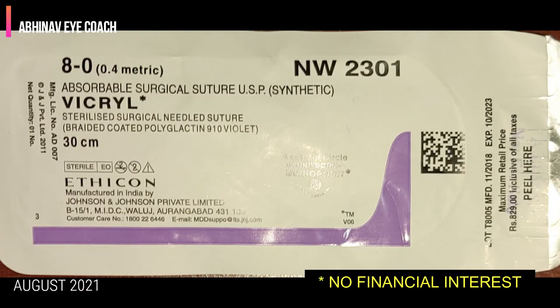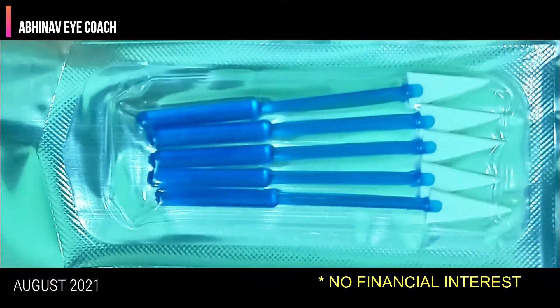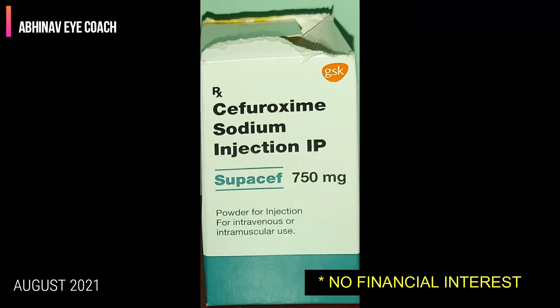These are the list of consumables: 8-0 Vicryl suture, PVA sponge or Waxcel sponge, Mitomycin C injection, 10-0 nylon suture, and cefuroxime injection.